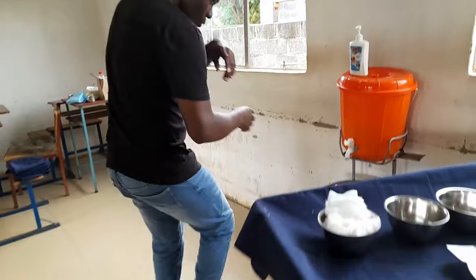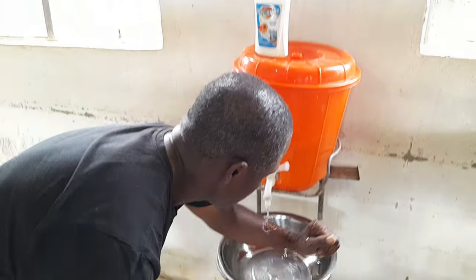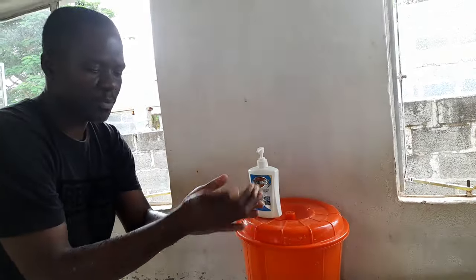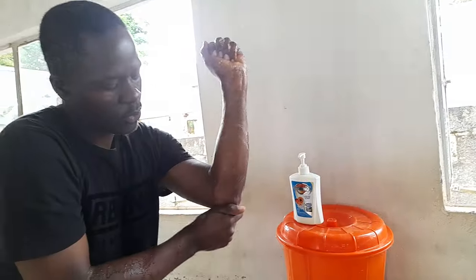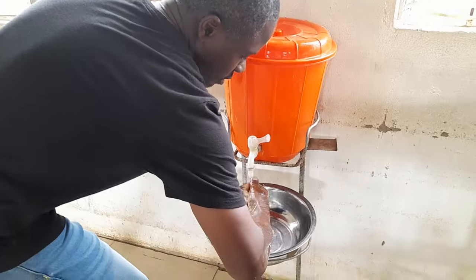You are now set to scrub. Perform the surgical hand scrub: scrub one side then the other, then scrub the top — one, two, three — then go past your elbow, drop the elbow, and release.